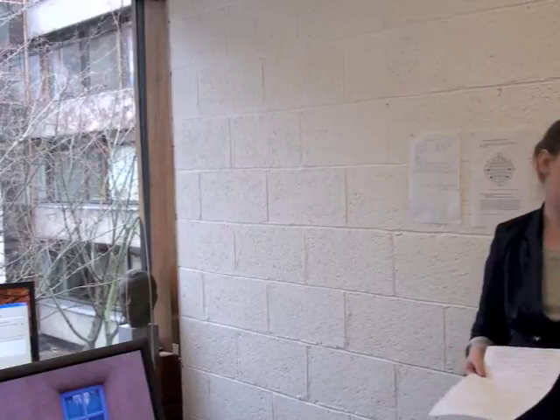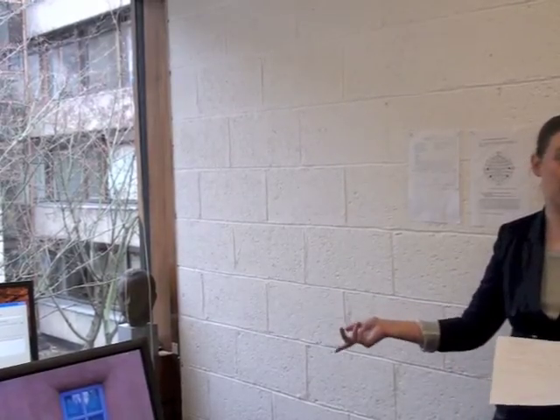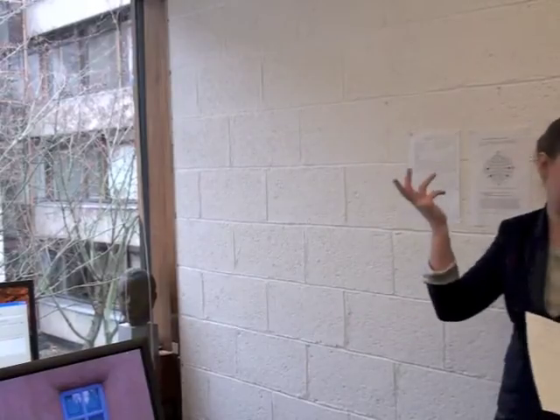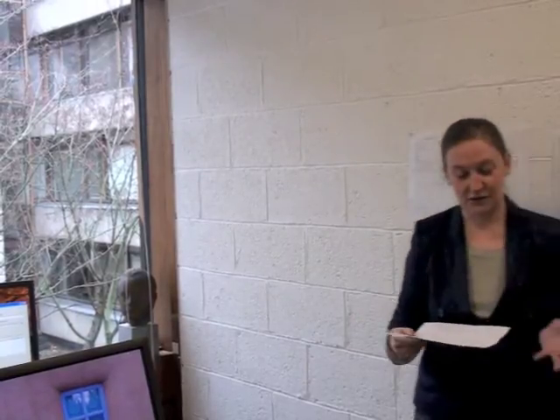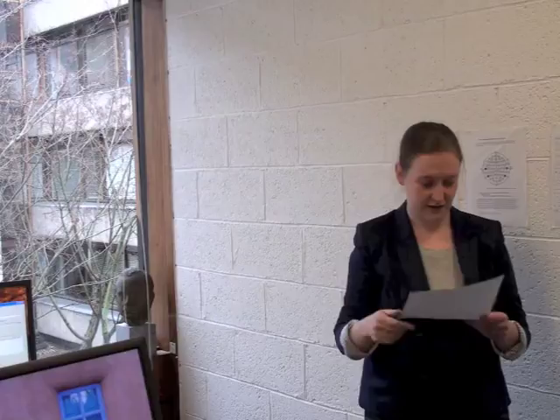You can see that it's cold here today. Anything like this will register in a participant. If the participant is very hungry or very cold, it's going to register, it's going to interfere. So make sure they've eaten, make sure they've gone to the toilet, and make sure that they're warm enough. Toilet is particularly important because they're going to be there for maybe 2 hours, and they can't move. And if they do need to go to the toilet, it's really obvious in their head.